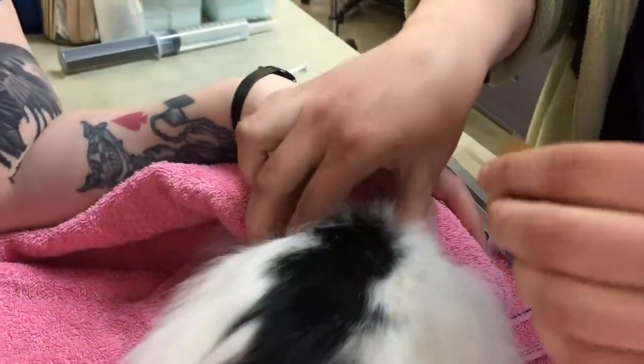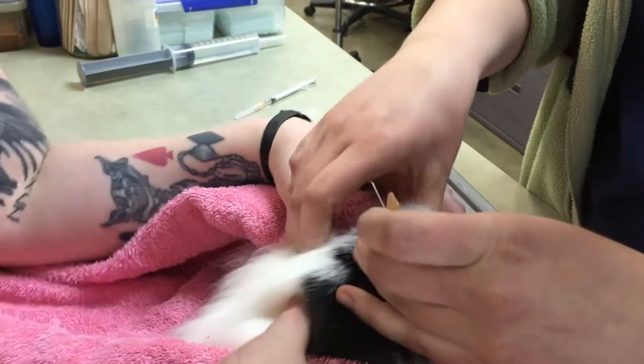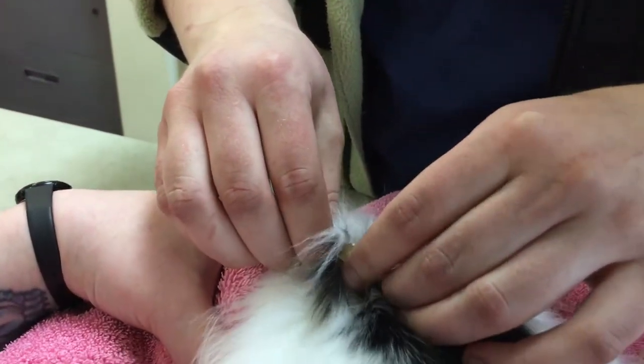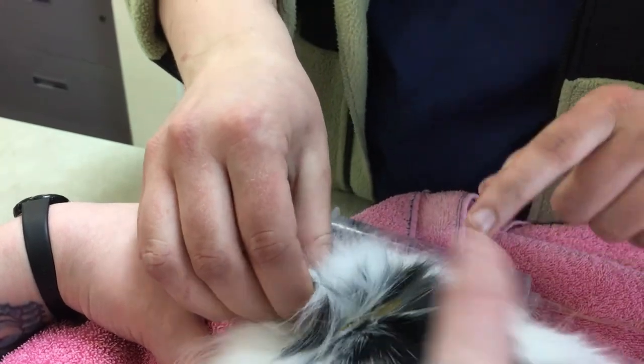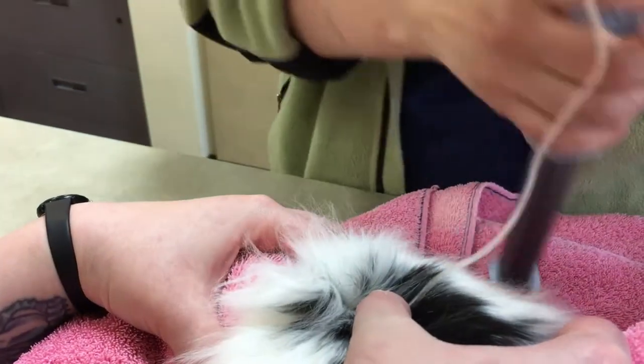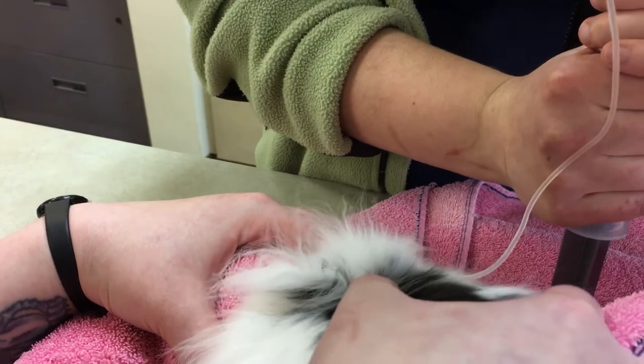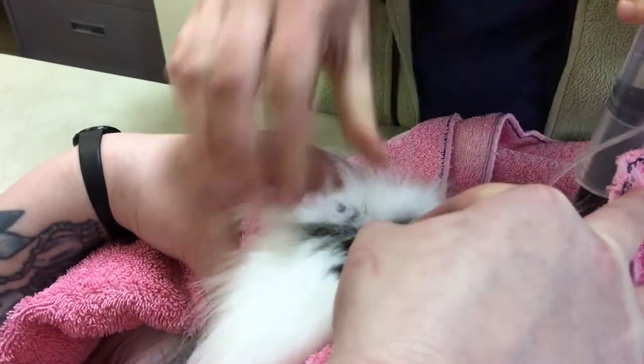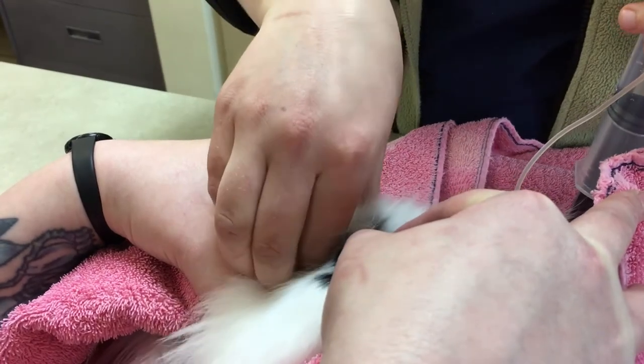Casey is going to cover his face just to make sure he's nice and secure and comfortable for this. Quick poke. Usually I have my holder just put a finger on that butterfly catheter just to make sure it doesn't go flying out. Check to make sure we're in the right place.